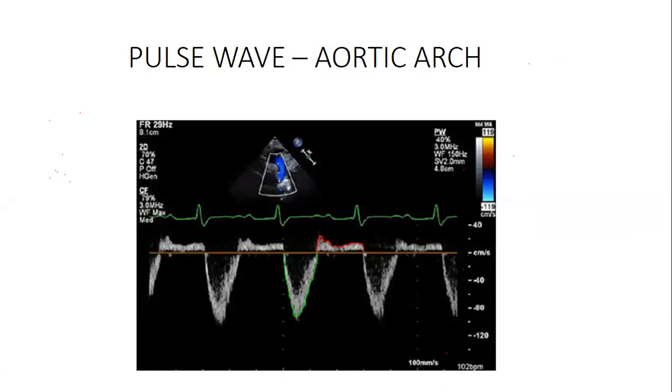Okay, this was the aortic arch. This is the aortic arch. So when you look at this, we know how the aorta is moving. We know how the aortic arch is moving.